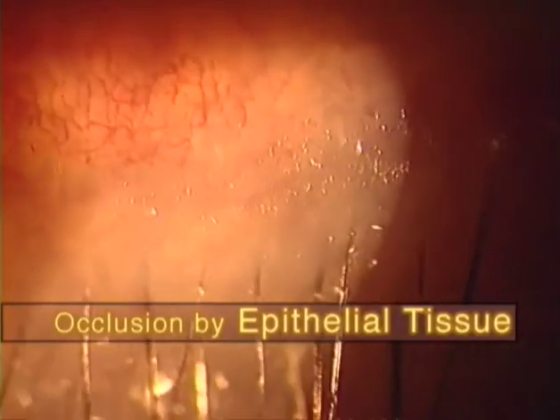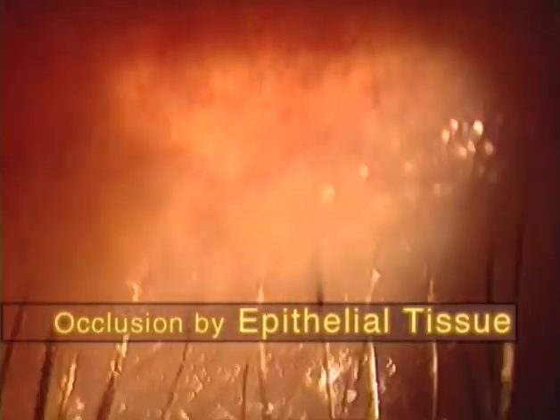In this next case, with marked epithelial thickening, the excretory ducts have been elongated. The ducts appearing glassy in lateral indirect illumination have no connections with the outside, as demonstrated by the specular reflexes which are not interrupted and thus show no signs of open orifices.